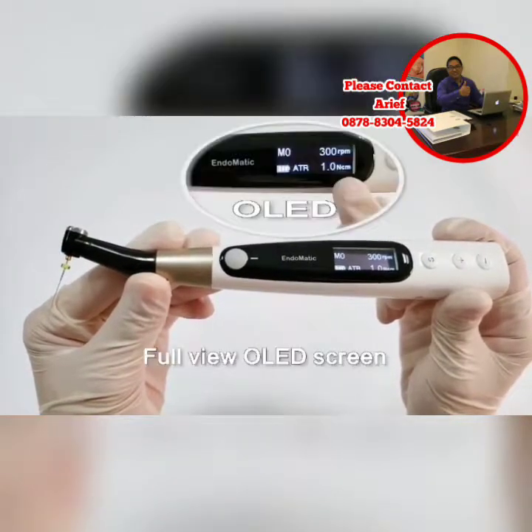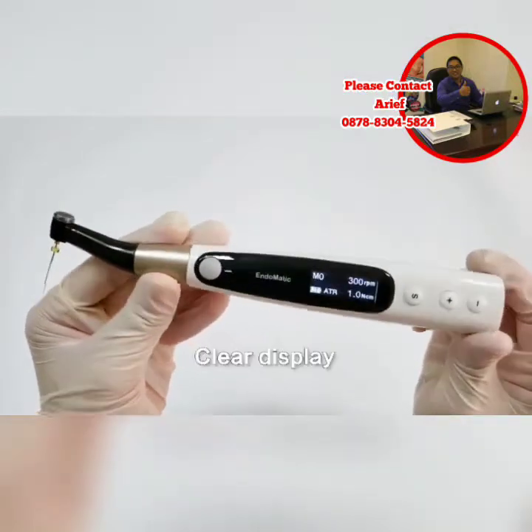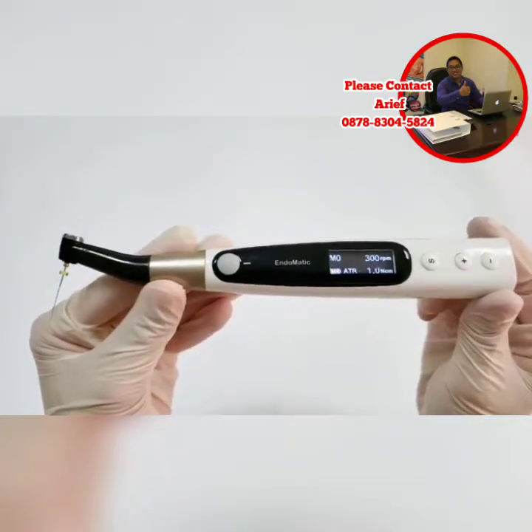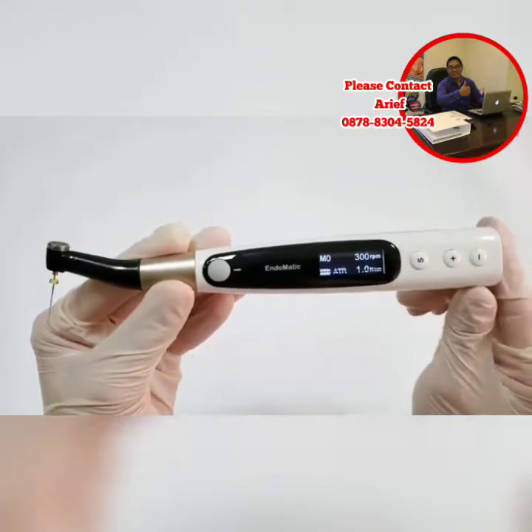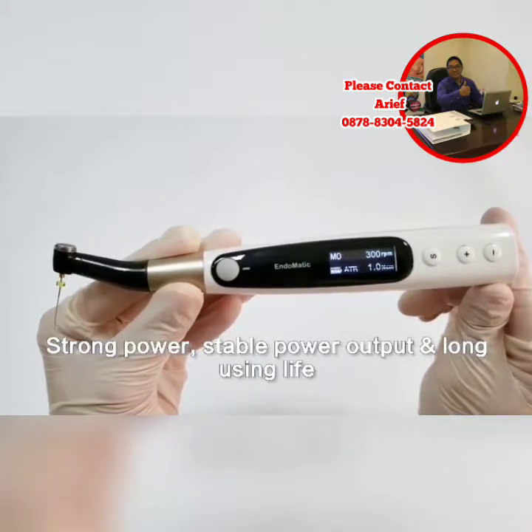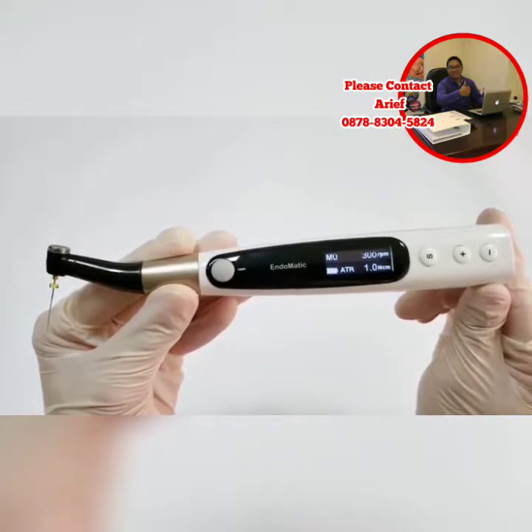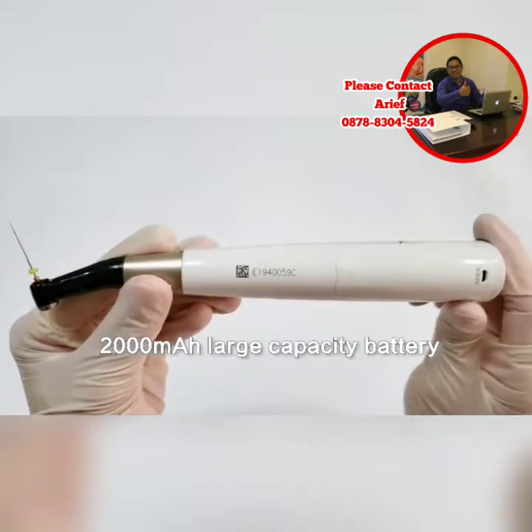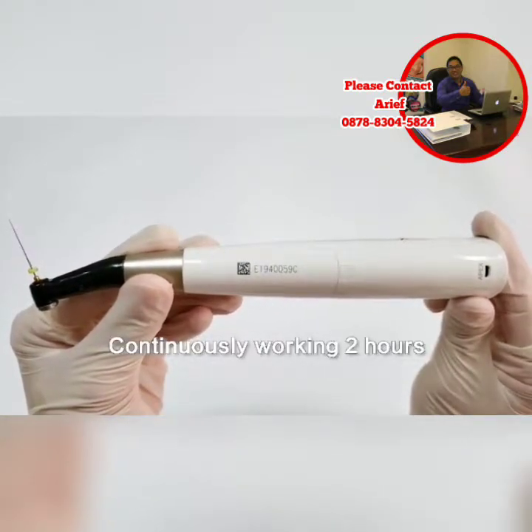Endermatic adopts a full-view OLED screen, so it's easy to see the information on the display from all angles. Endermatic has a high-quality Japanese electric motor, thereby ensuring strong power, stable output, and long service life. In order to ensure the usage time, Endermatic adopts a 2000mAh large-capacity battery, so it can continuously work for 2 hours.